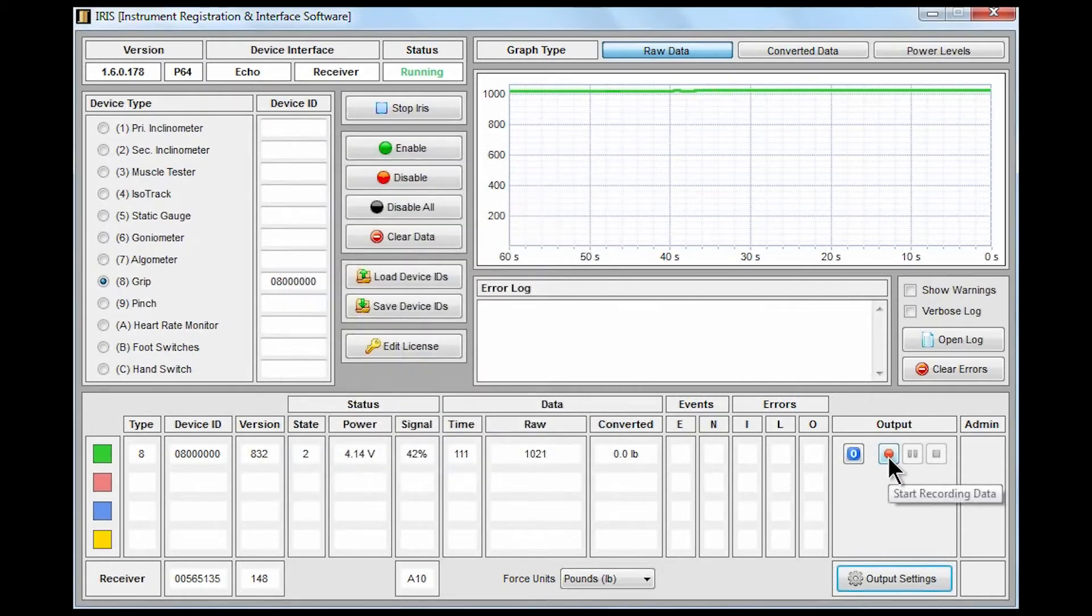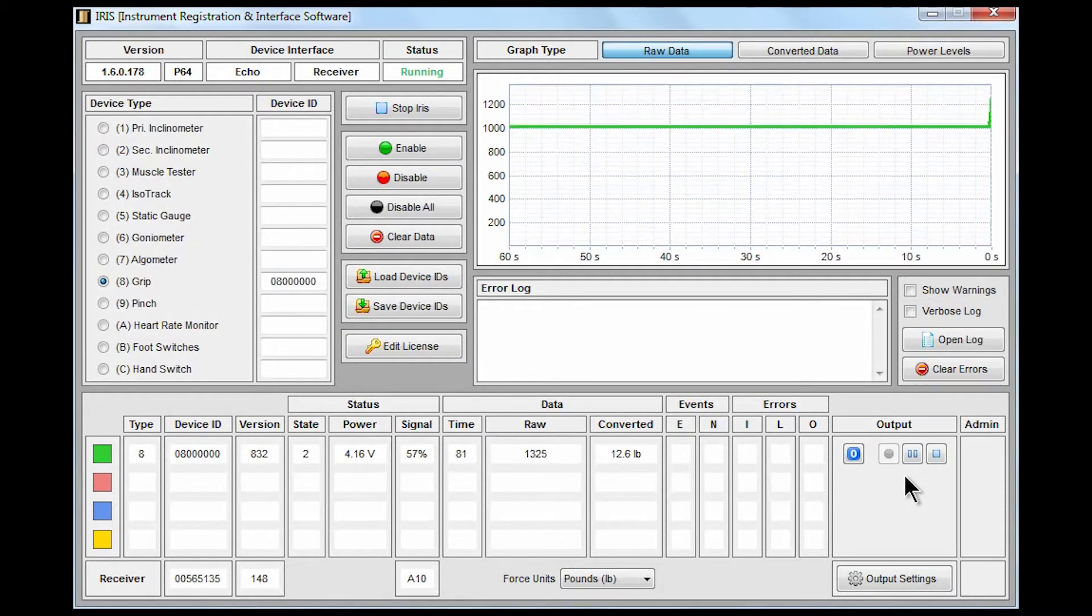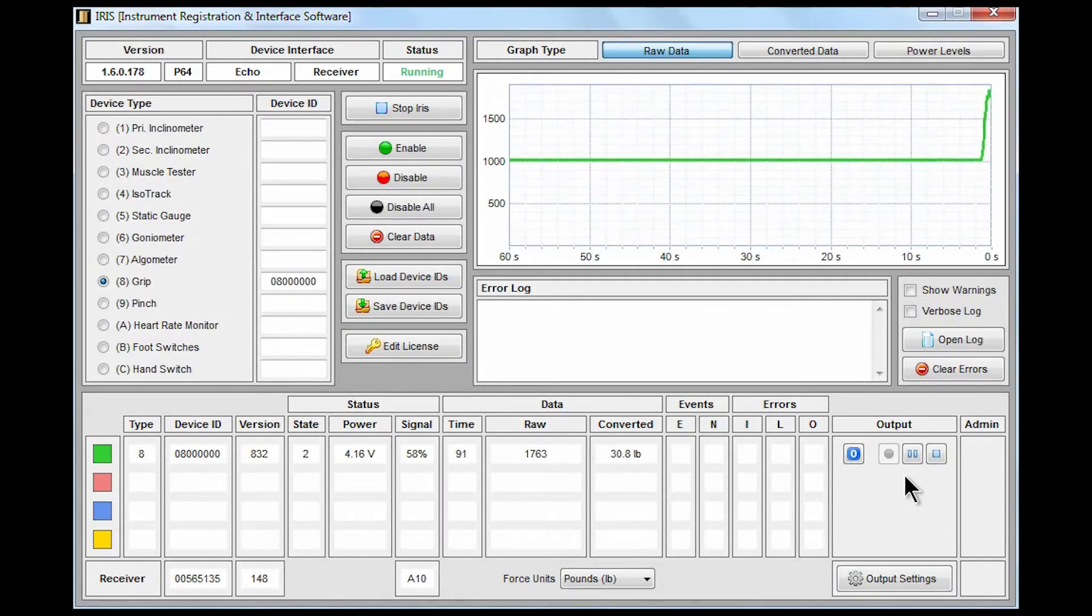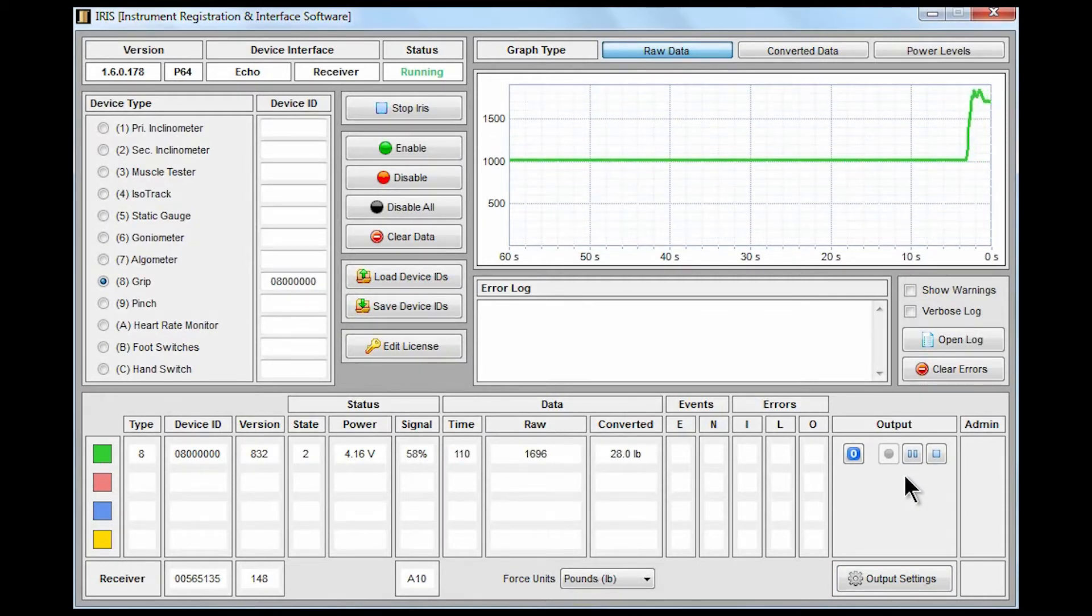I'm going to go ahead and start recording output from the device, and as I start to apply force to the device—again just squeezing on the grip gauge—we actually see I'm sustaining a grip here and that value is being recorded to our output file.